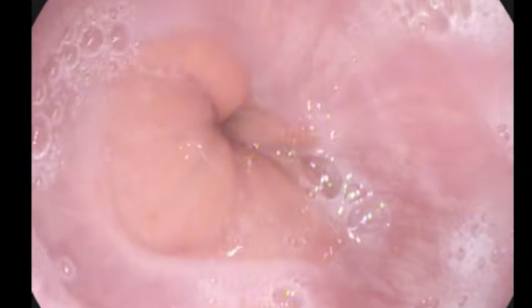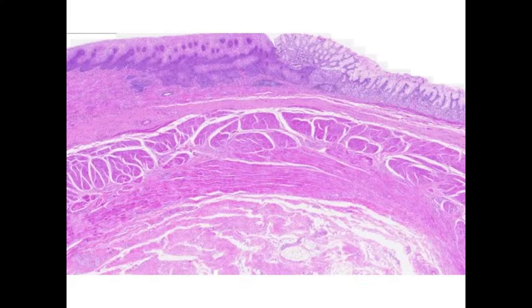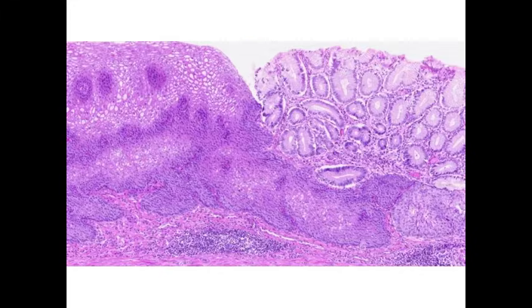The epithelial transition from the smooth, stratified squamous epithelium of the esophagus to the simple columnar epithelium of the cardiac stomach can be seen. Histological section of this junction shows this distinct transition. Also note the esophageal cardiac glands located in the lamina propria, which function to secrete a mucus solution that protects the esophageal mucosa from the acidic contents of the stomach. Here is a closer look at this transition.